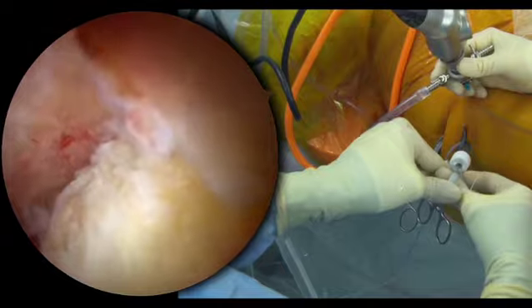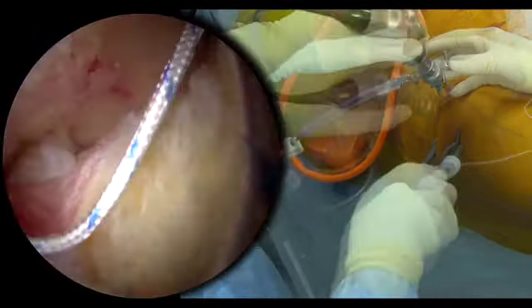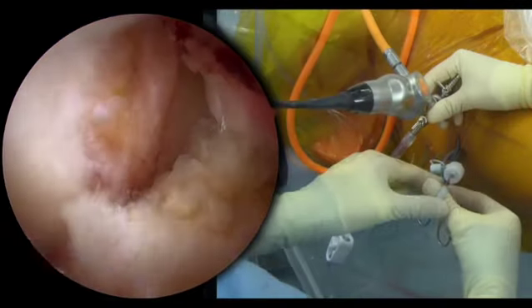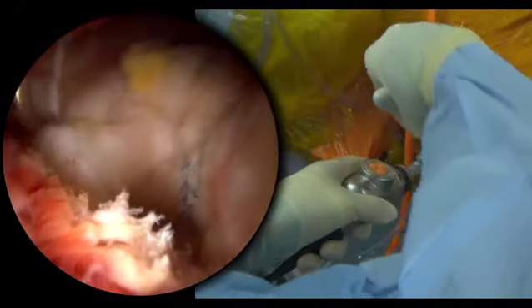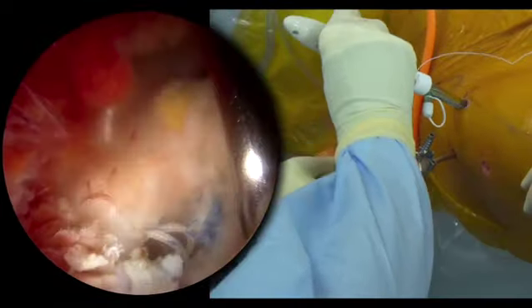We work our way proximal with the use of a suture passer as we take some tension off the traction stitches that were placed previously, which allows us to plicate the capsule even further. Finally, the interportal capsulotomy is closed with the use of the same suture passer while viewing from the anterolateral portal. As you can see, the spaces get smaller here as we work our way up.